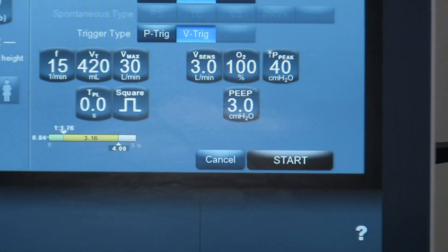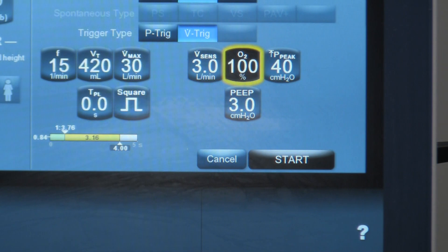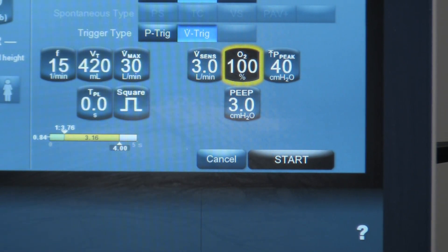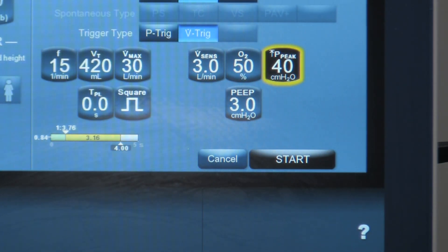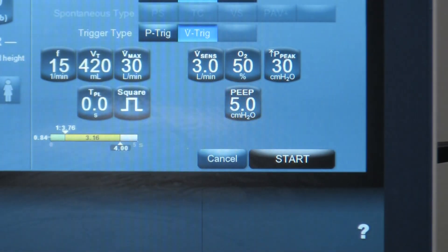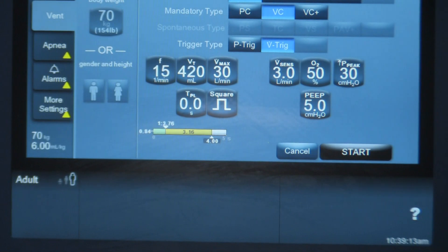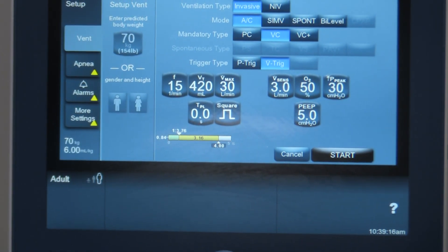The next things to set on that side of the screen: flow sensitivity. It's based on the trigger capabilities of your patient, but you go anywhere between 2 to 3 liters per minute. FiO2 — no lung impairment with this patient and they're oxygenating fine on the bag, so I can go a bit lower. I'm going to start at 50. High pressure — I don't know what the pressure is going to be since I'm volume ventilating, but I'm going to set it to 30 as a safety. And PEEP — no cerebral impairment, so we're going to start at PEEP level 5, anywhere between 5 to 6 centimeters of water pressure.